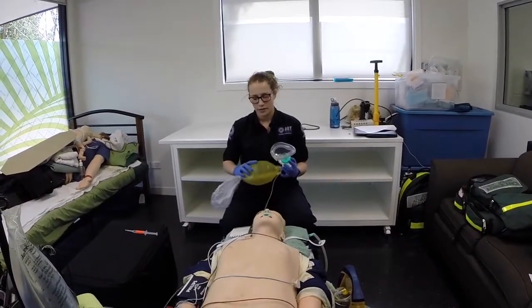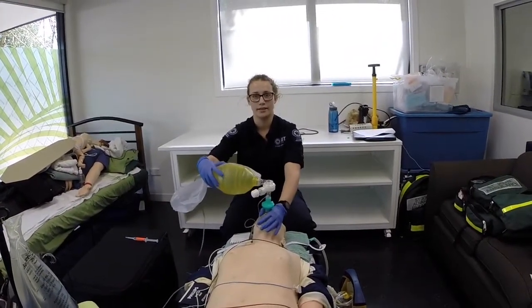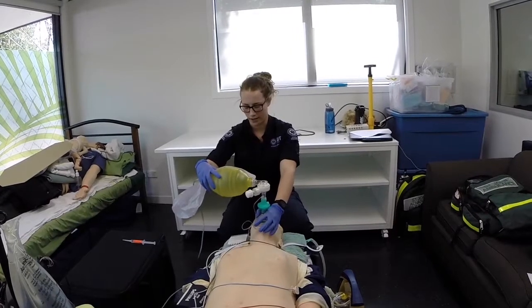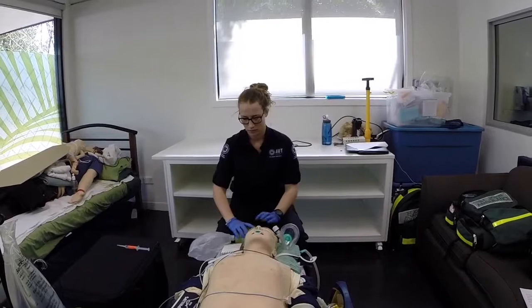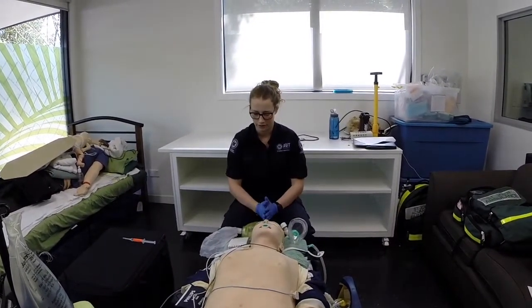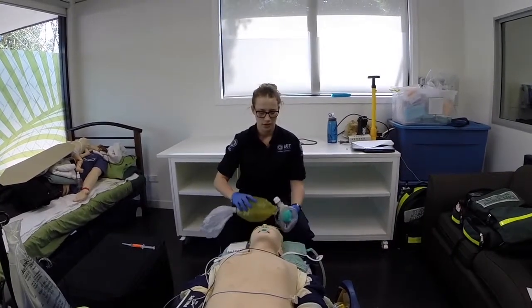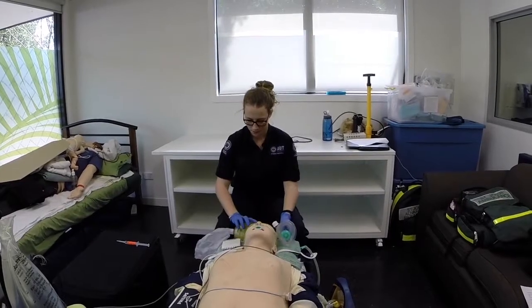So we don't have a reservoir mask, but we've got a BVM that I can just hold over the patient and then we can supplement them that way. Attach monitor with ECG, NIBP and SpO2. Which we have all done along here, which will be monitored every 5 minutes. Prepare ETCO2 if this is available. So we've got this now attached to our BVM mask.